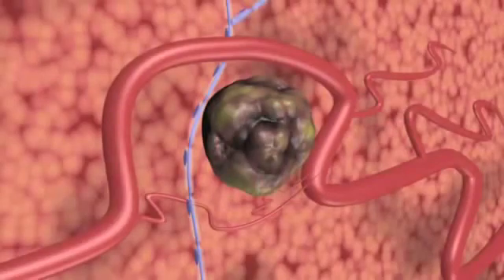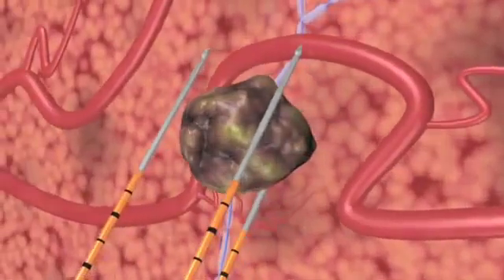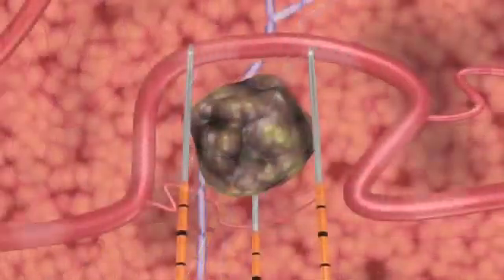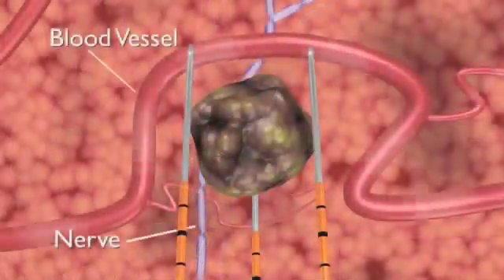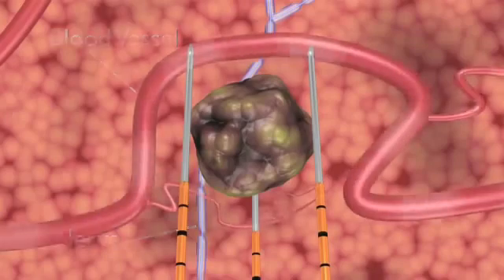NanoKnife IRE treatment induces cell death in soft tissue only. NanoKnife IRE electrodes are placed in proximity to the targeted tumor, but unlike thermal ablation technologies, surrounding critical structures including nerves and blood vessels remain functional.